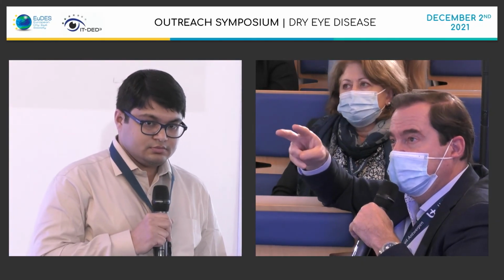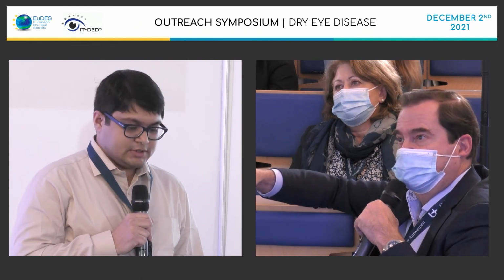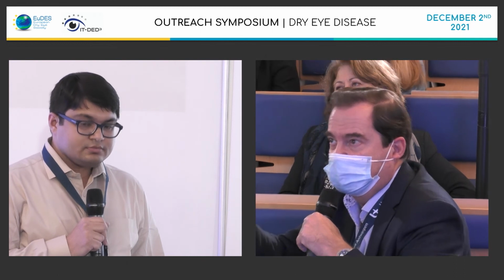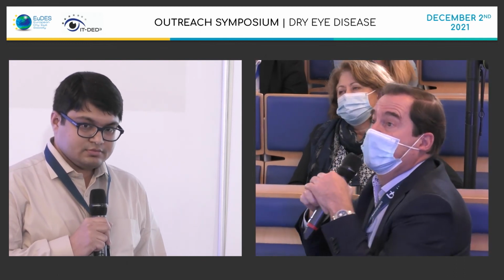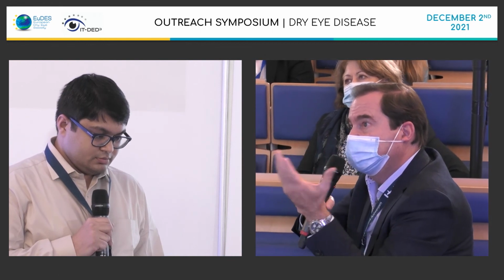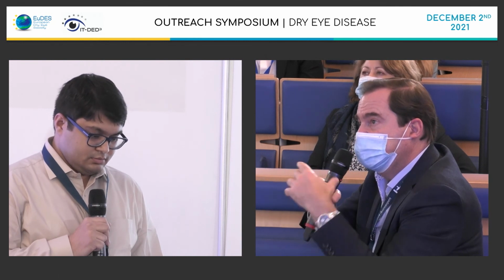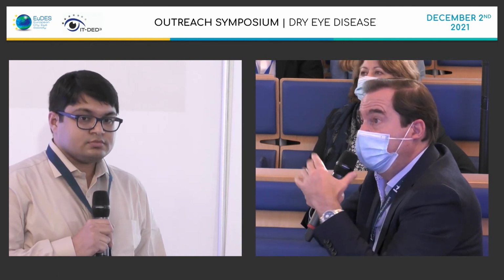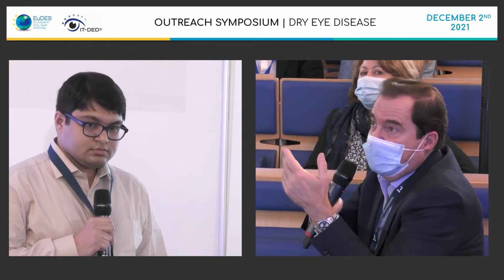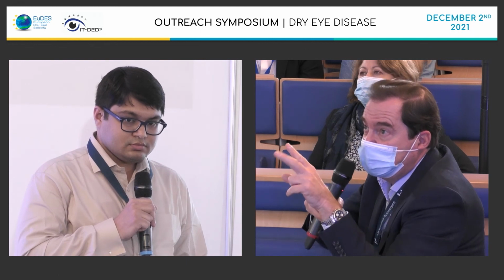But here you have the combination of blood vessels and lymphatic vessels. Yes, because they are moving, but the lymphatic vessels are transparent at the slit lamp. And this is the explanation. So it's fascinating to observe such images, because we know that for the first time, without any intervention or invasive methodology, we are looking at the lymphatic vessels. The problem is that I am still unable, and probably everybody is unable, to differentiate the two.